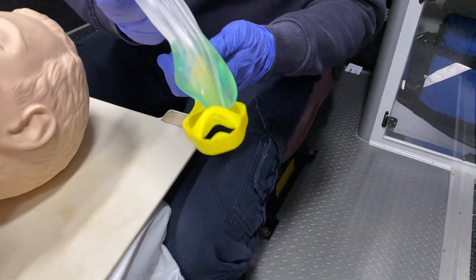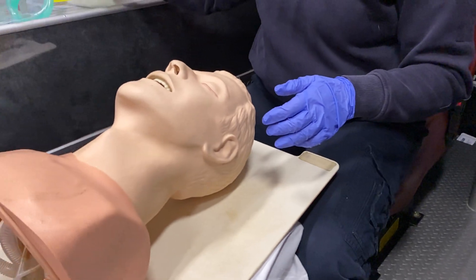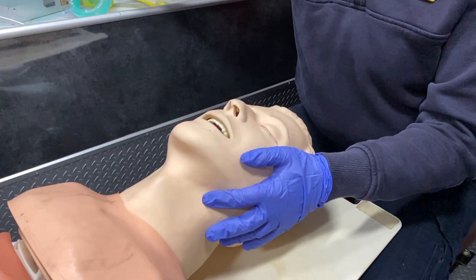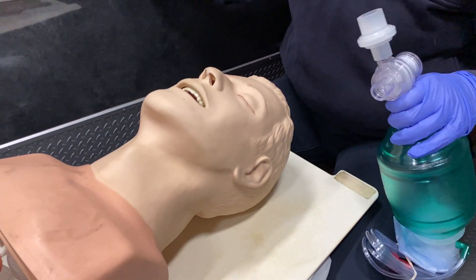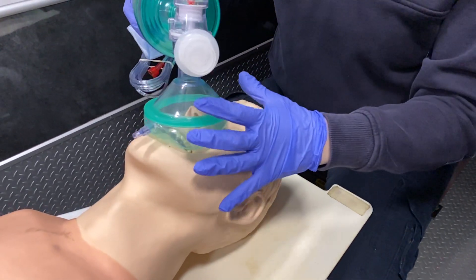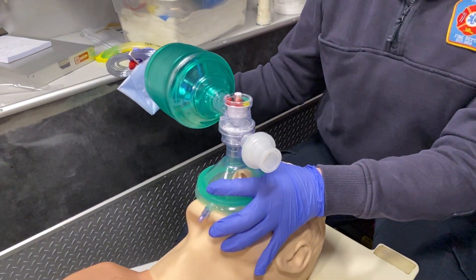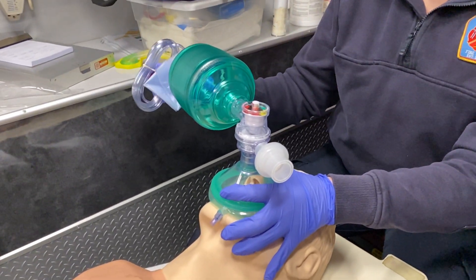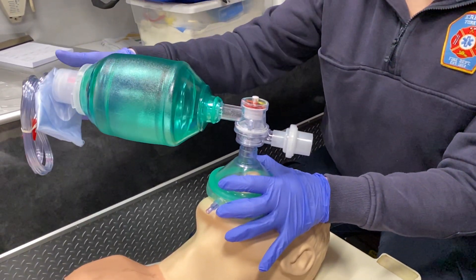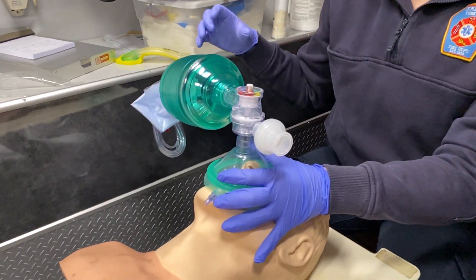Insertion is pretty easy — it is a blind insertion. Starting with our patient: they're found unconscious with a pulse but not breathing. We always want to start with BVM ventilation. Hook up your oxygen to 15 liters per minute. The reservoir bag does not need to be fully inflated to begin bagging your patient.